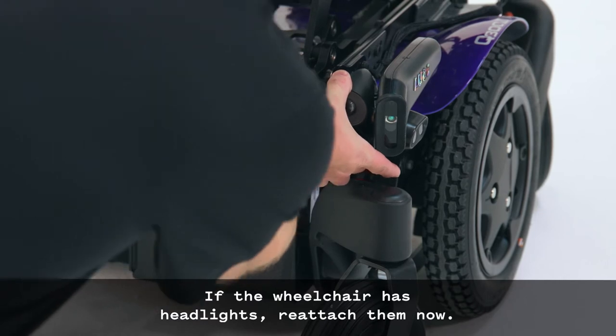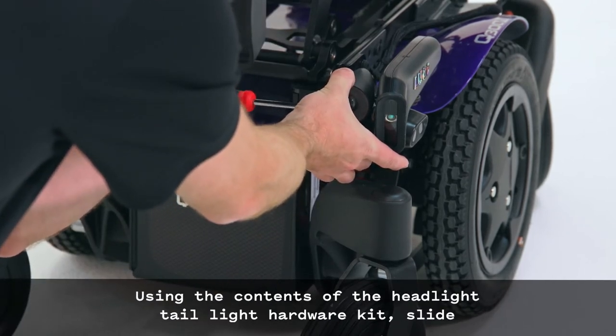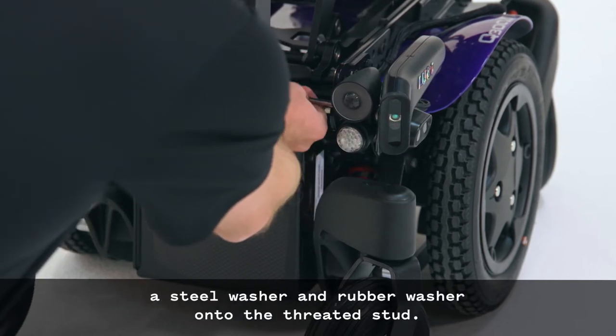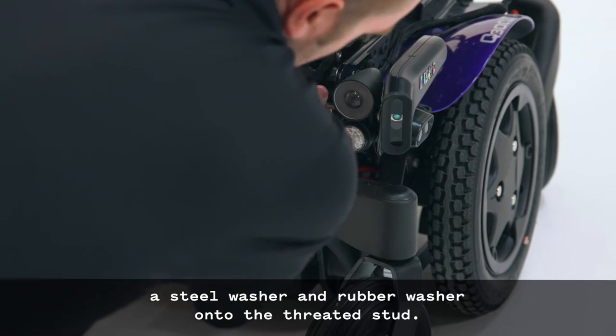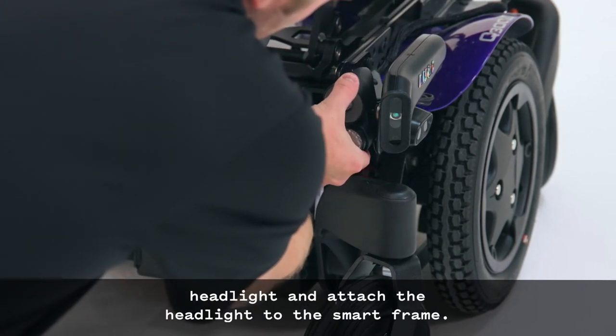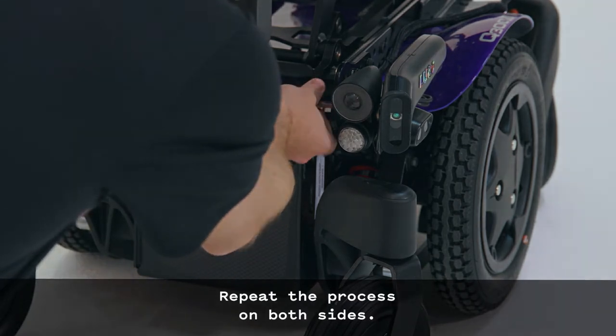If the wheelchair has headlights, reattach them now. Using the contents of the headlight taillight hardware kit, slide a steel washer and rubber washer onto the threaded stud. Insert the M4x25mm screw into the headlight and attach the headlight to the smart frame. Repeat the process on both sides.